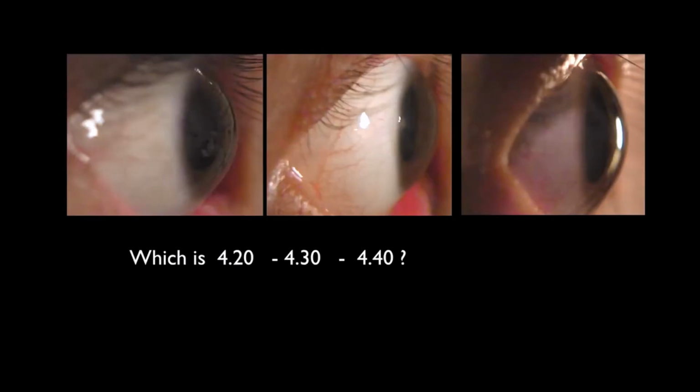So now we have 3 patients. They all have fairly similar corneas, but if you look more carefully, you'll see that the corneas have slightly different depths to them, and the scleras are slightly different. So which eye would I put the 420 sag lens on? Which eye would I put the 430 sag lens on? And which eye would require the 440 sag lens? Well, let's ponder that for a moment.